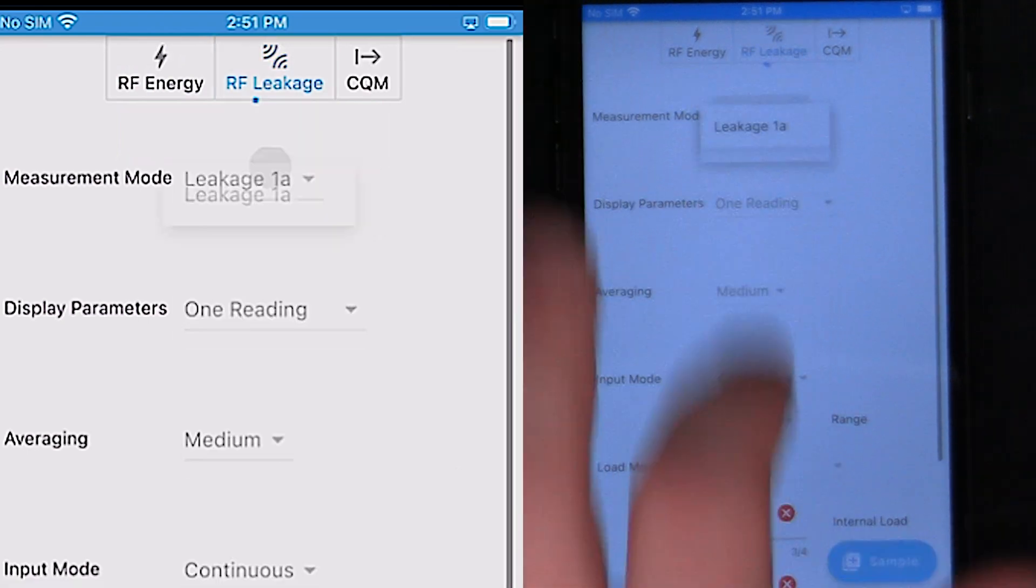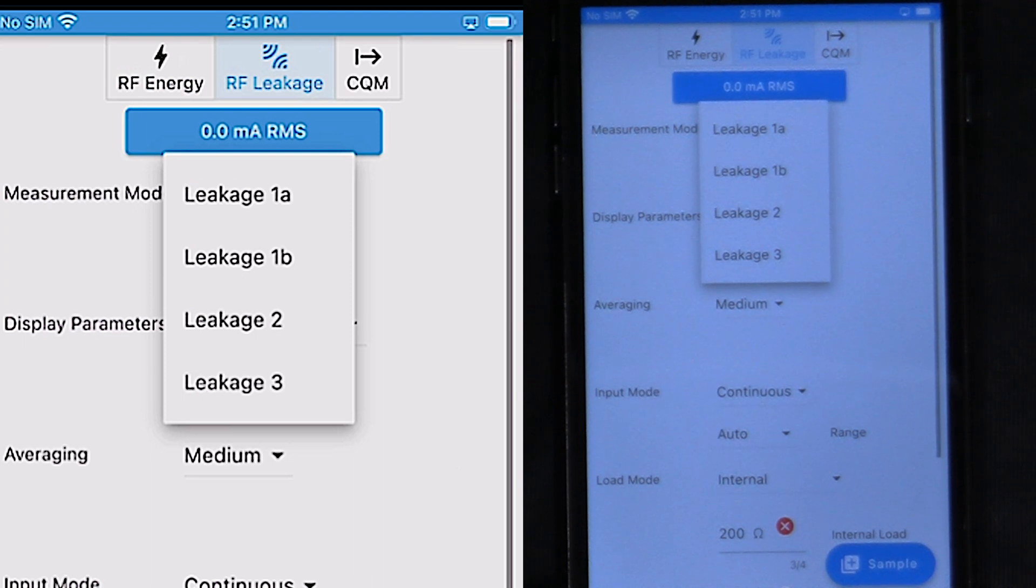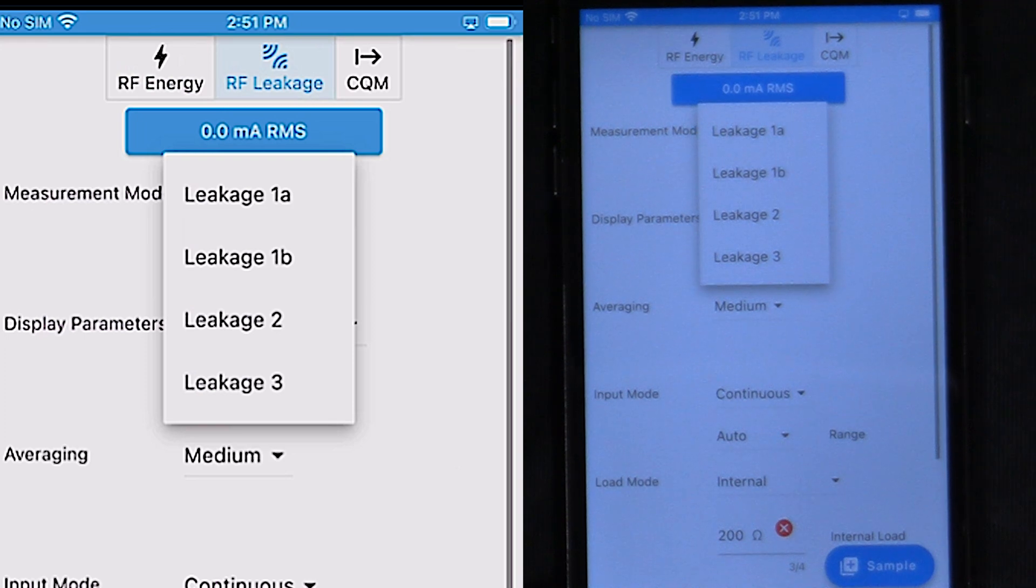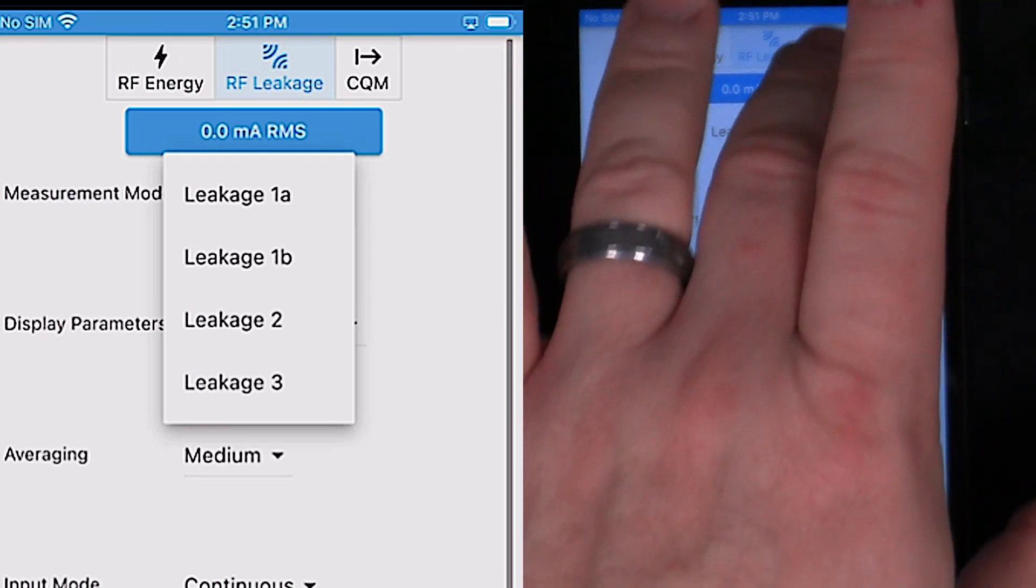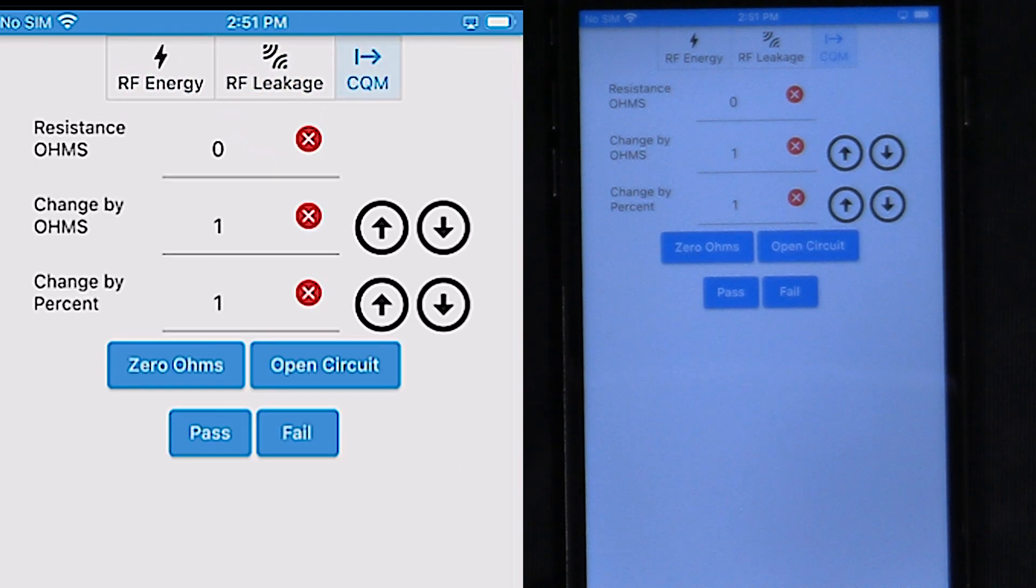We have leakage 1, 1A, 1B. 1B is for testing the REM port. Leakage mode 2 and 3 are for testing the generator under load. We can also move over to CQM testing. That will allow us to simulate a CQM load for the generator.